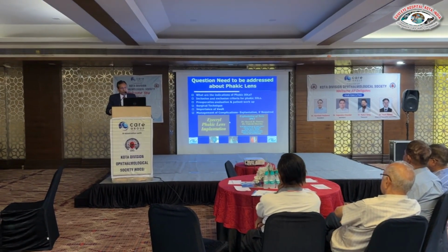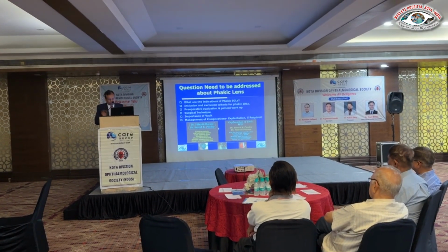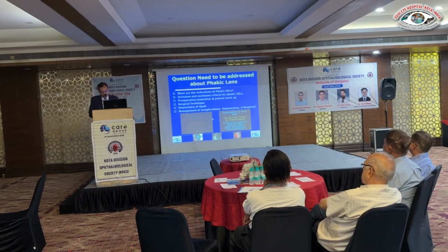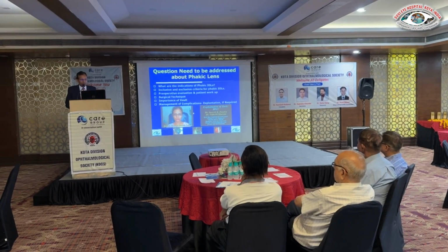The beautiful part of Phakic lens implantation is that it is a reversible surgery. You can explant it and change it if there is an undersize issue, or some other issue, and then you can work to address that issue.